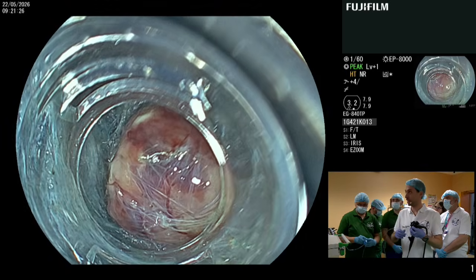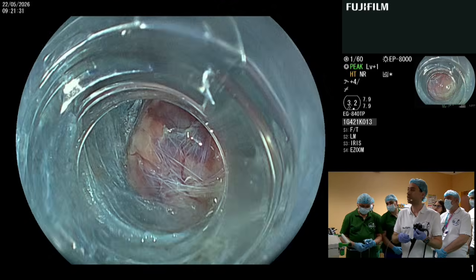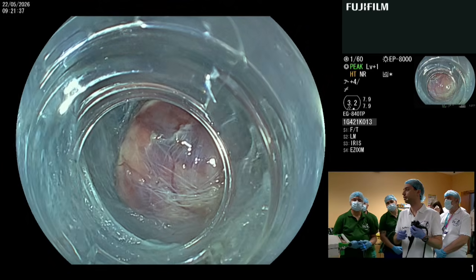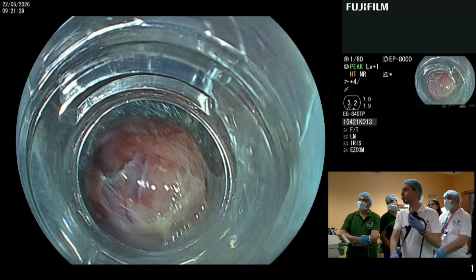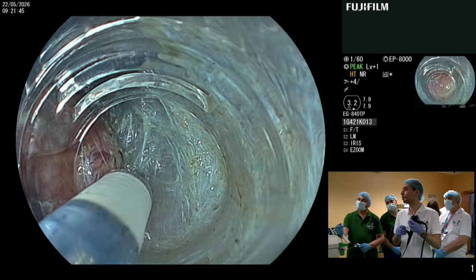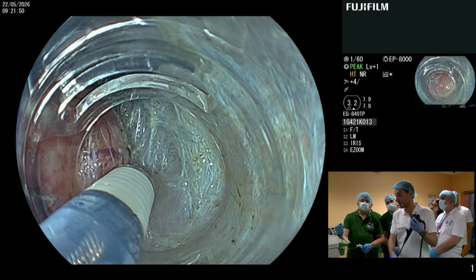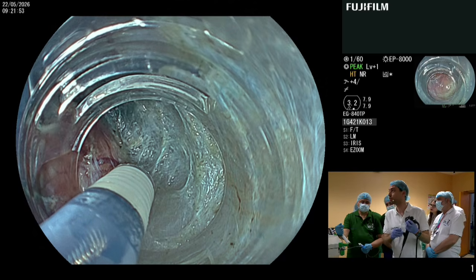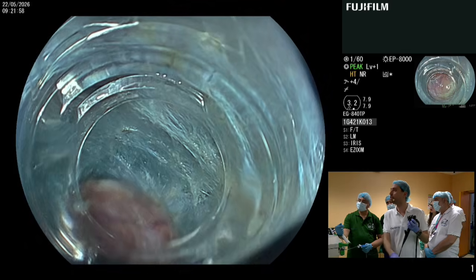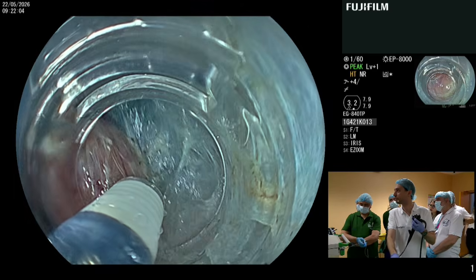Another point I would like to discuss. Once we remove the tumor, we will give it to the pathologist. So often the pathologist comments that the resection is R1. Do you know why he does that? He does that because the pathologist is used to receive wedge resections. And in wedge resections, the tumor has mucosa, submucosa, and normal wall around it. In this case, we do not do wedge resection, we do enucleation. So the answer is that the pathologist cannot comment on the R0 resection. He can only tell us if there is damage of the capsule.